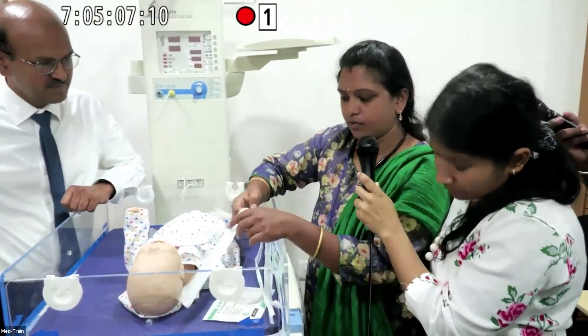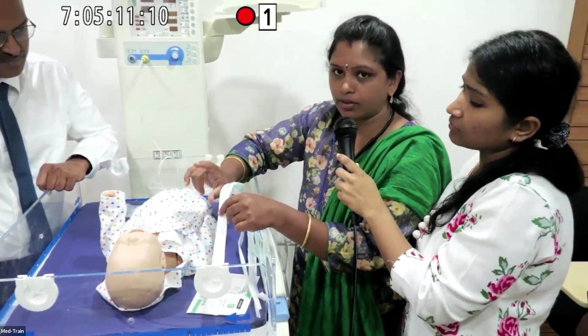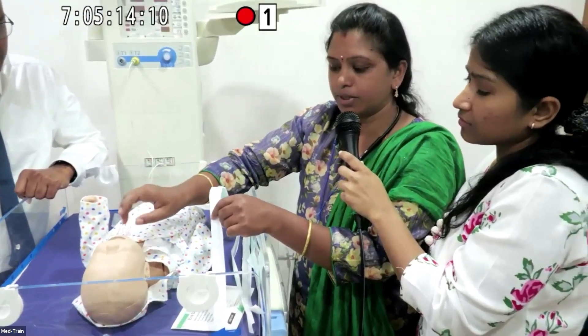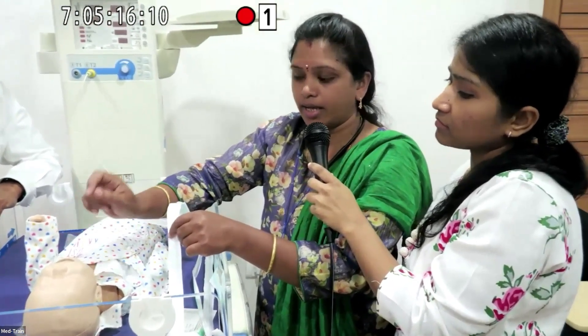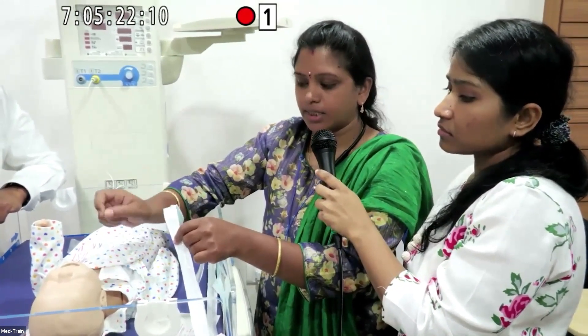For ET tube suctioning, you have to measure the ET tube depth. If it is fixed at 14, you can go deeper by plus one and do the suctioning using a sterile two-person technique with the help of the doctors.